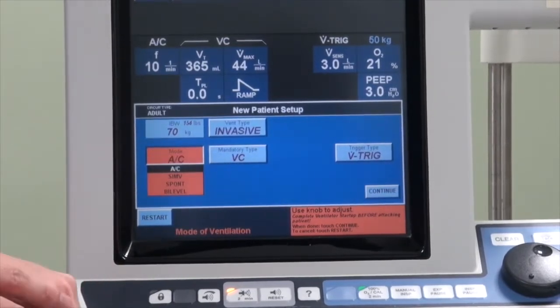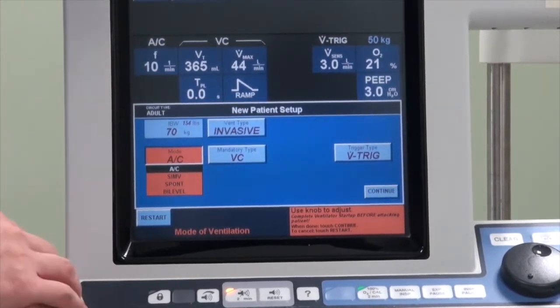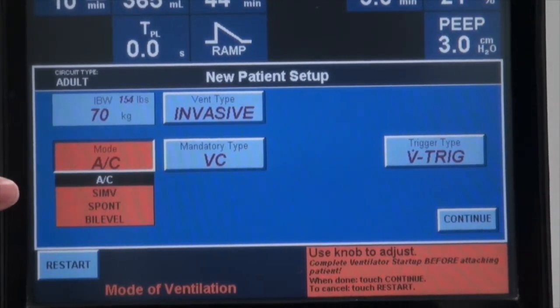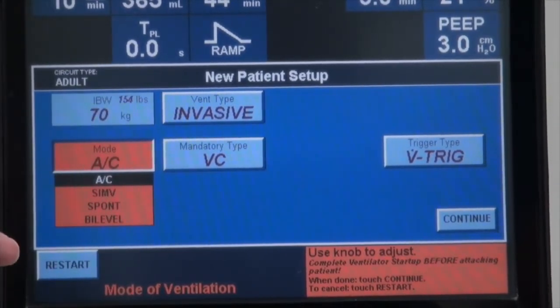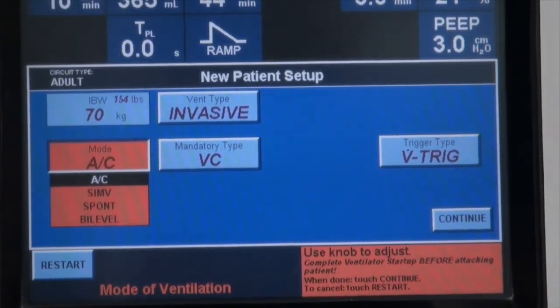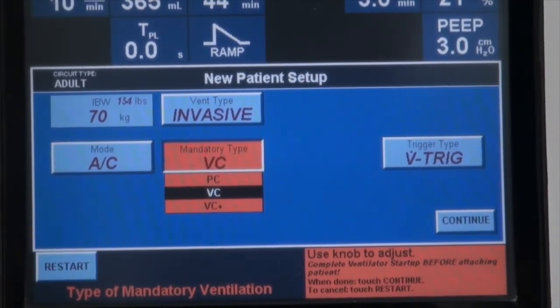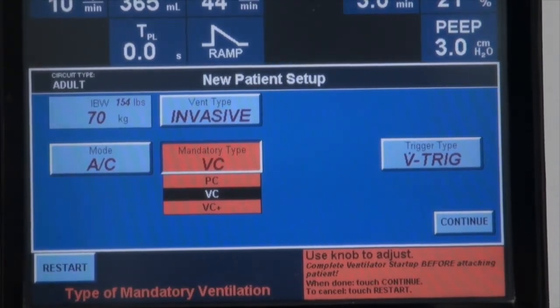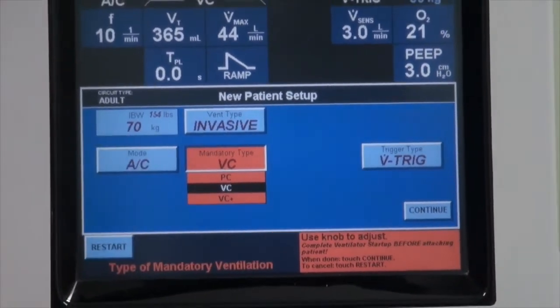Depending on the software that comes with the machine, you will see various modes that regulate how the ventilator delivers the breath. For this particular machine, there is assist control, synchronized intermittent mandatory ventilation (SIMV), a spontaneous mode of ventilation which is pressure support ventilation, and you can also do bi-level ventilation. For this demonstration, we will be choosing assist control. You can regulate the breath using volume control or pressure control, with an additional option of volume control plus, which is equivalent to pressure-regulated volume control on other ventilators. For today's session, we will focus on assist control using the volume control mode.